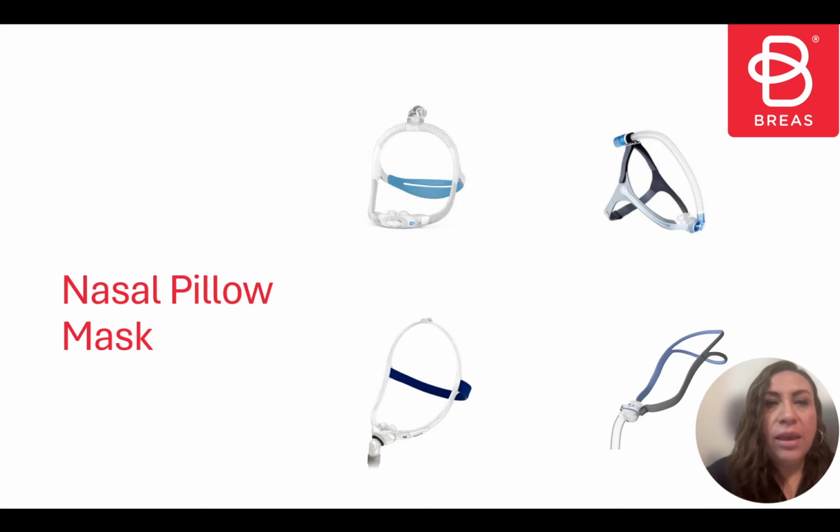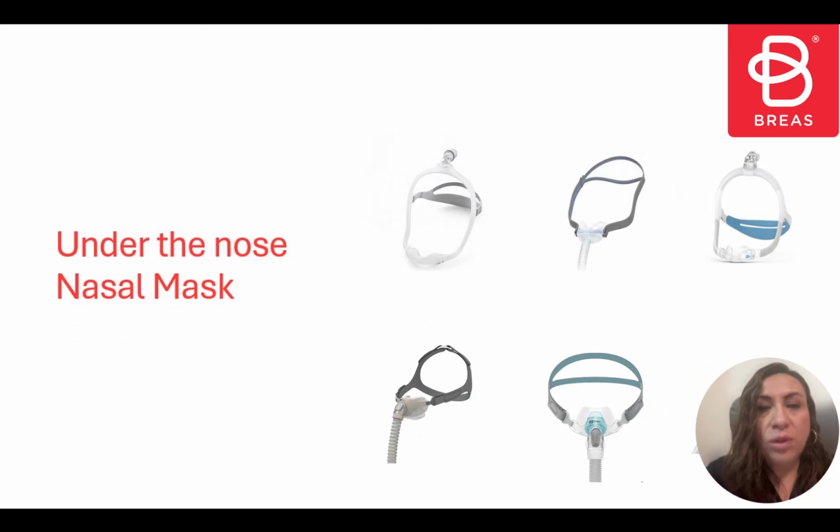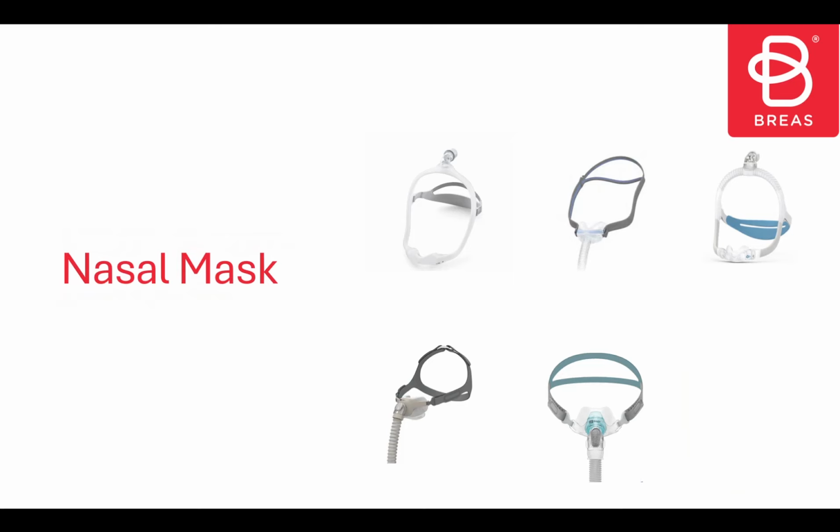Here we have some examples of nasal pillow masks. We call them nasal pillow masks when there is a part of the mask that will go inside the nostrils. That's why they are called nasal pillow masks. We have under the nose masks, that is masks that don't cover the entire nose, but sit a little below the nose. We have different types and models, sometimes with the leaks that are deported, as we see in this example, and here too.